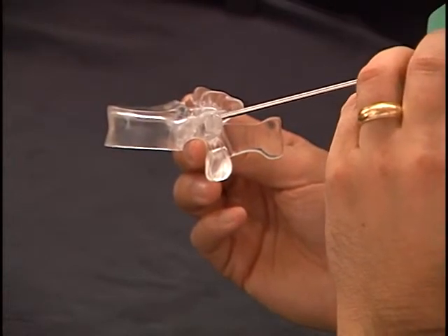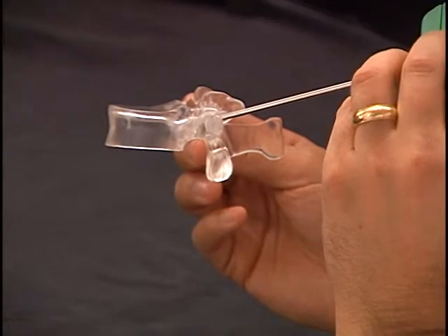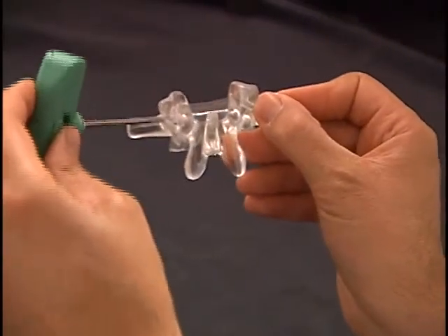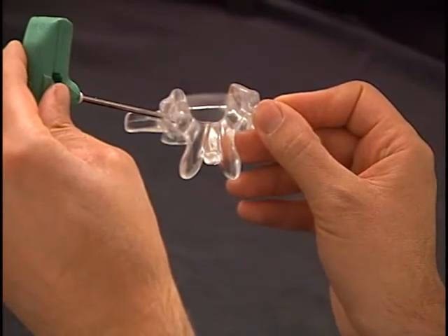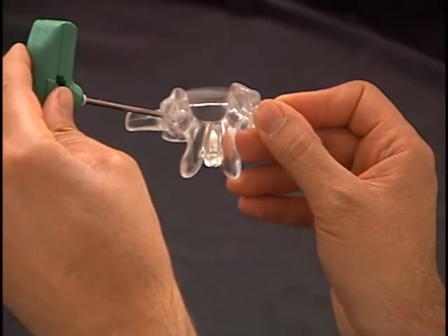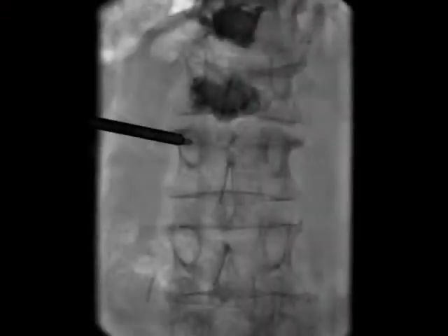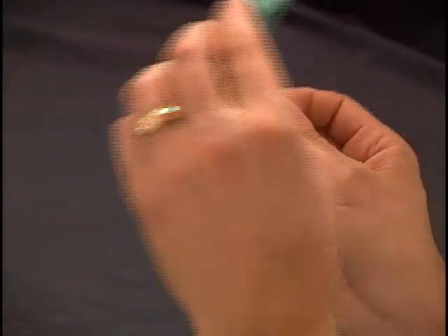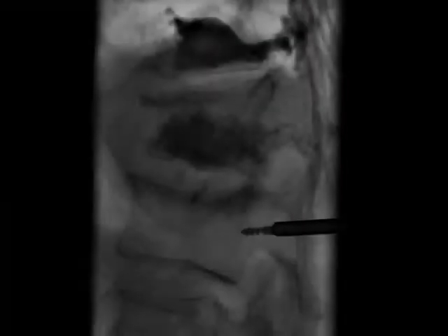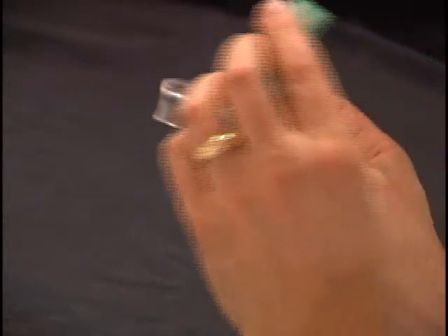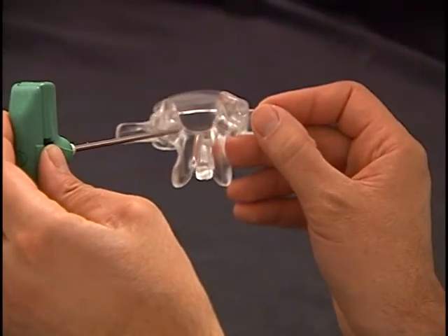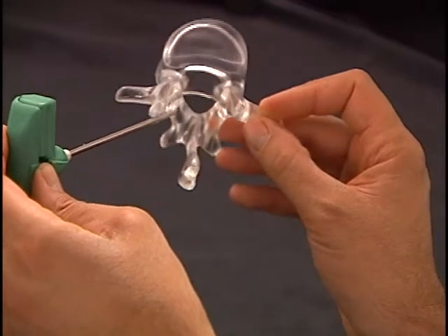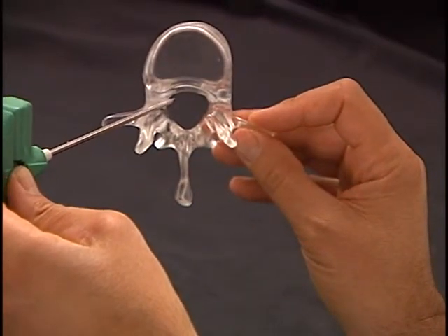Once I'm satisfied with the cranial-caudal trajectory of my instrument, I return to the AP fluoroscopic image for a key safety feature. It's important during advancement of the jamshidi through the pedicle that the tip of your instrument remain lateral to the medial edge of the pedicle on AP fluoroscopy until it enters the posterior cortical margin of the vertebral body on lateral fluoroscopy. If at any time your instrument tip is medial to the medial edge of the pedicle before entering the vertebral body, it has breached the medial pedicle and is now in the spinal canal.